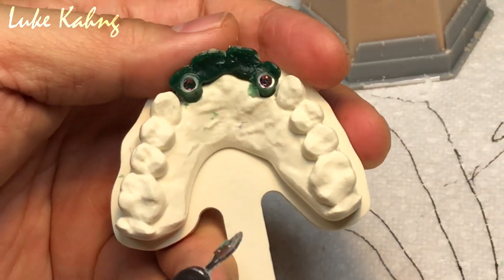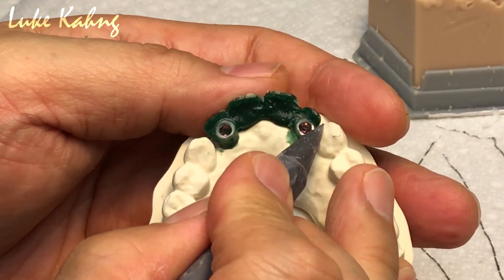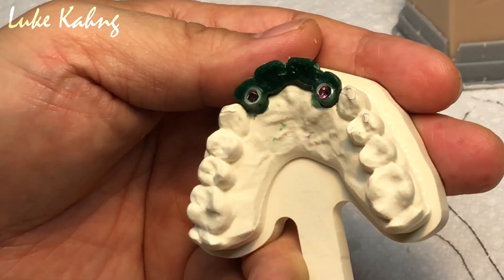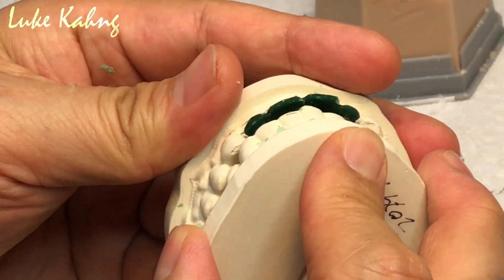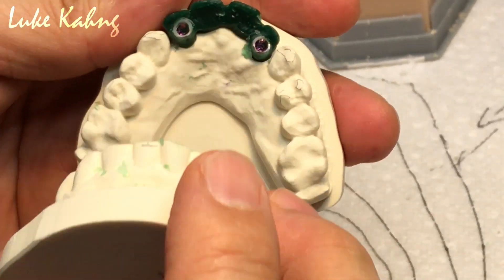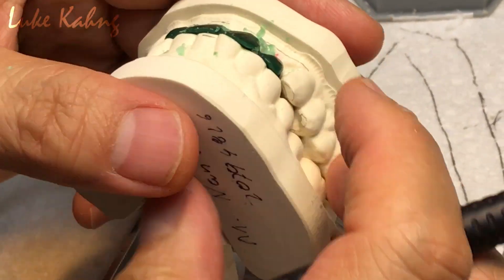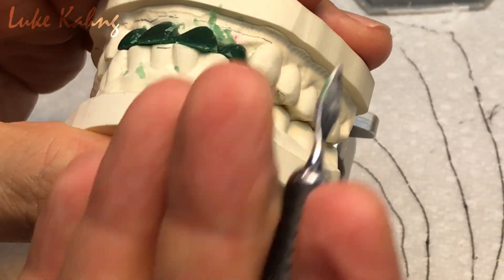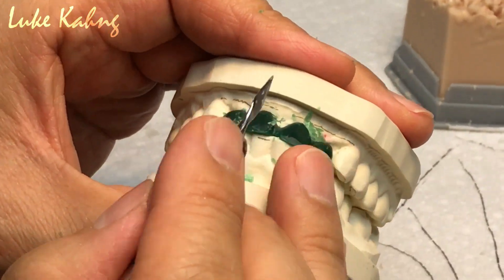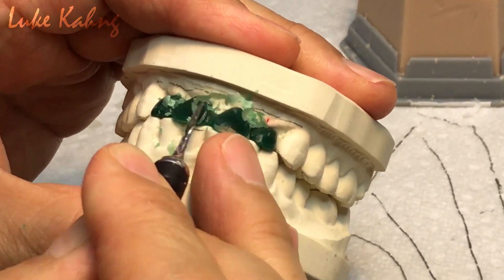So you see the grind pattern — meaning zigzagging, go over. So I have to make this. Right now bite is good. I'm trying to bring in a little bit, and protrusion is good. There's no stock, so it itself has a freedom, which is good. Then I can grind a little bit more.